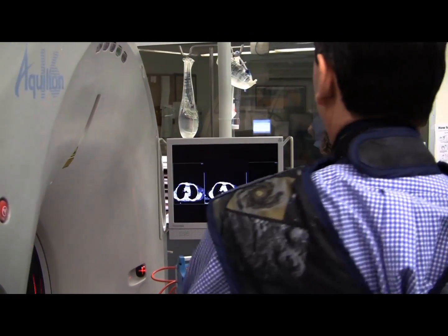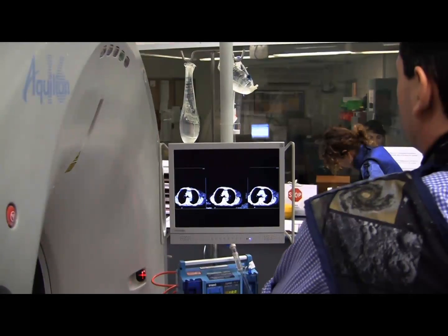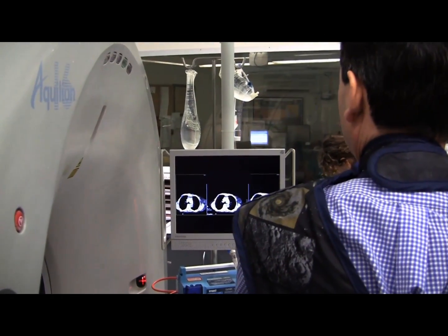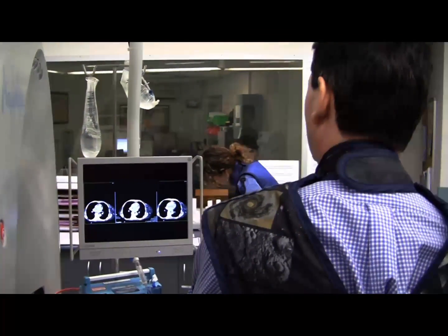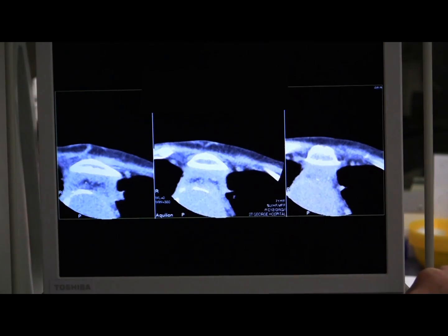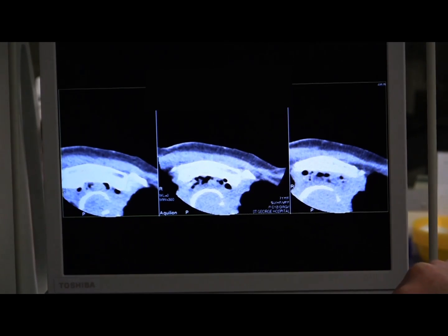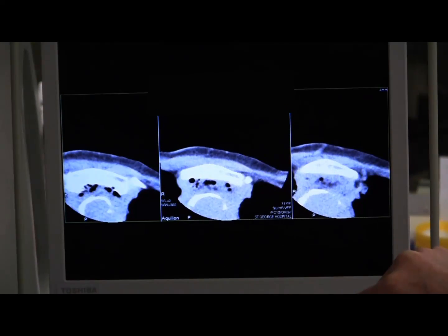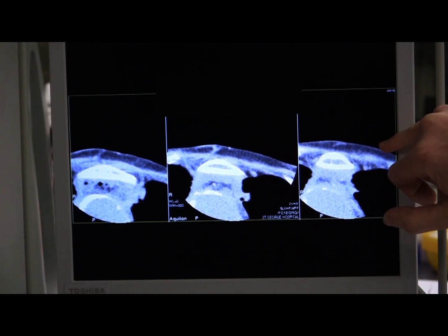Okay, let's have some zoom. We're coming in from patient's left, and we need more zoom, more dose. Let's take that up to, say, 40, and we're going retrosternal. So tube current 40 mA for a half-second exposure, and I'm just working out in my head what approach is going to get us to where we want to go.